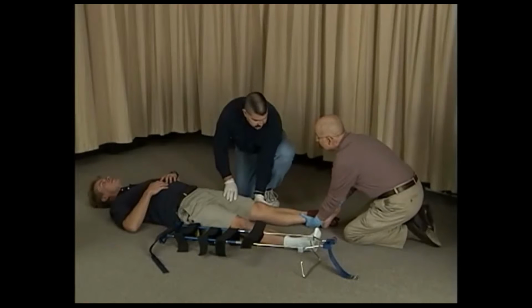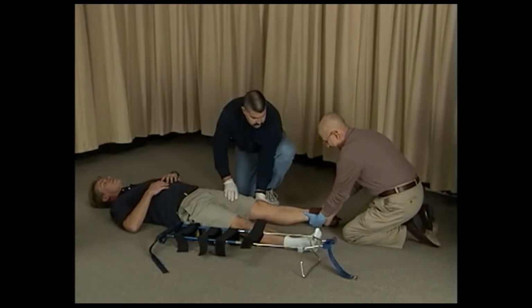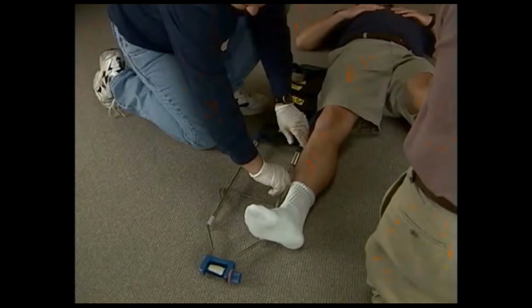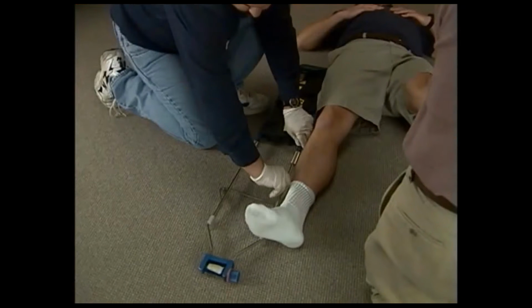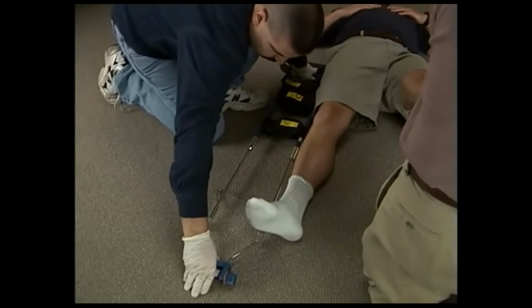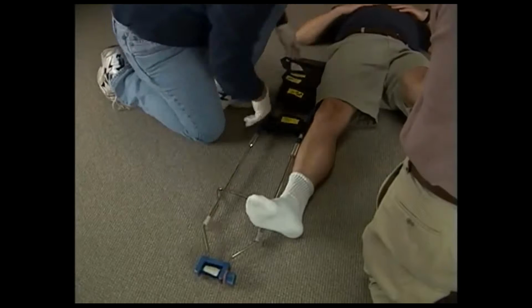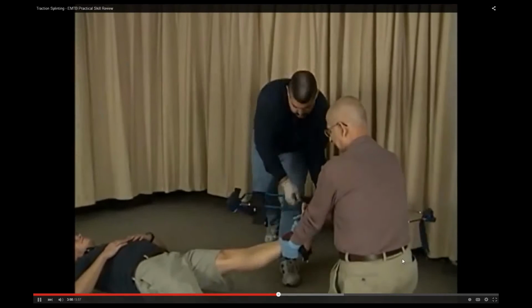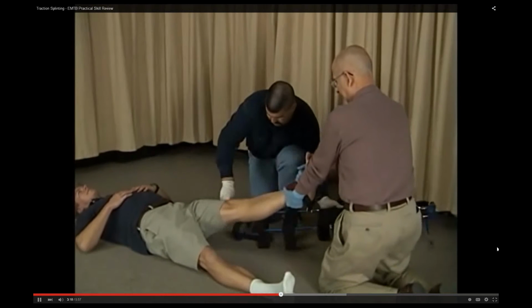Change my hand position. I'm going to direct him to pull traction. Go ahead. Measure and adjust the length of the splint against the patient's uninjured leg. Place the splint under the injured leg and position the straps.